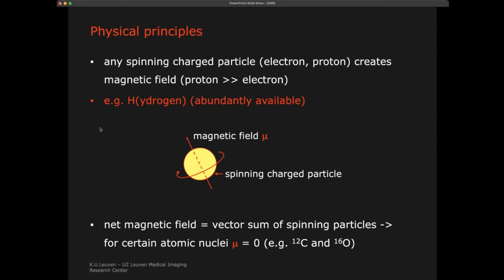There are ways to do magnetic resonance with other atoms, but that's extremely rare, so it's not used much in clinical practice. So we're going to focus on hydrogen-based, so actually water-based imaging.